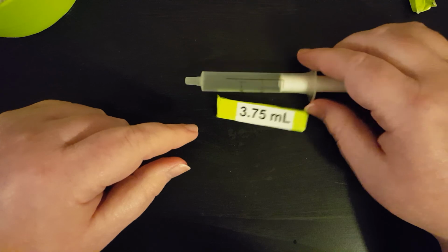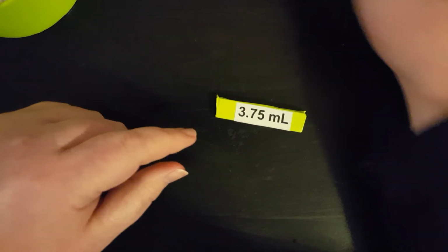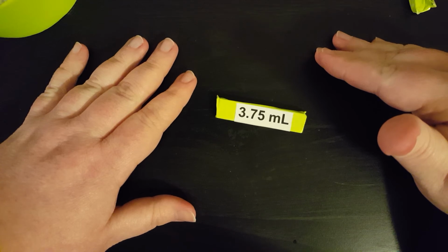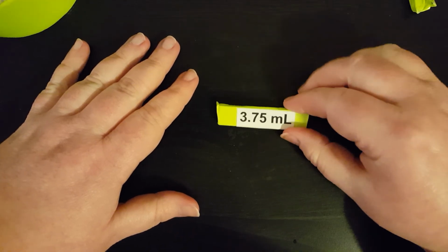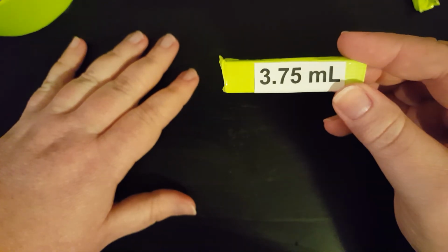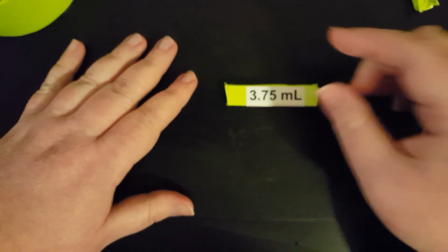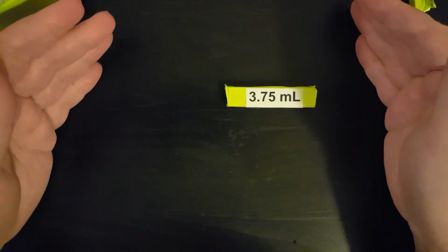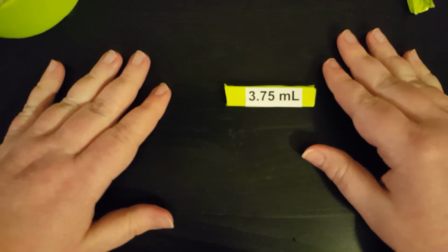or an audio labeling device or large print. You can even use bump dots if you think that would be helpful. 3 bump dots for 3.75. But it would be important for you to remember that it is 3.75 and not just 3. But it's something that could work. So many options with labeling. Whatever works for the person is what you should go with.